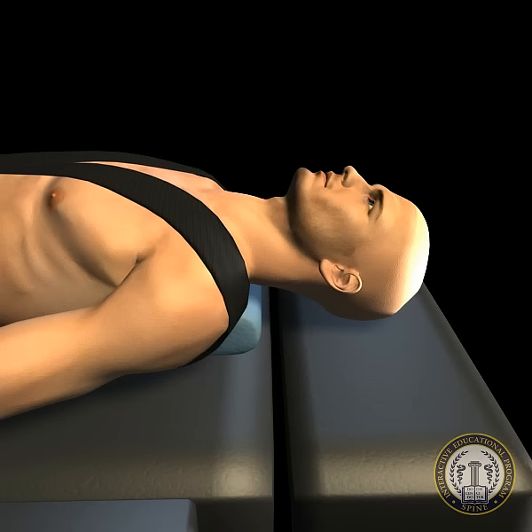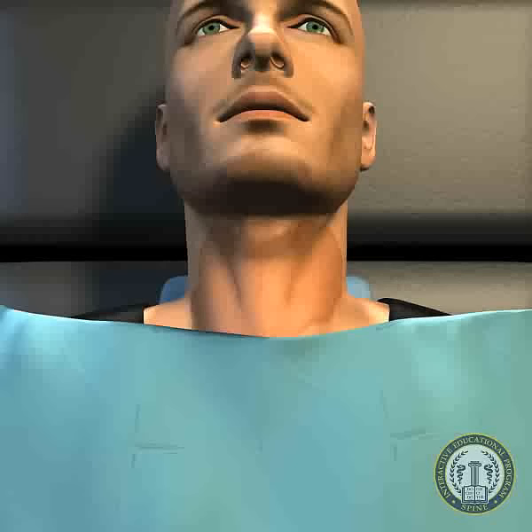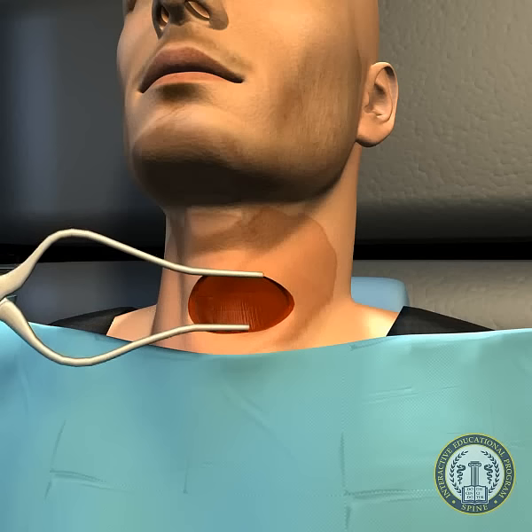The patient is now prepped and draped in sterile fashion. The skin is incised, the subcutaneous tissue plane developed to the platysma, and the platysma is then divided in longitudinal fashion.